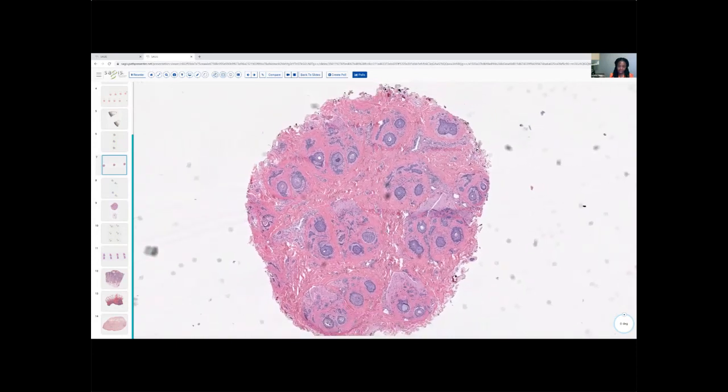We're in the isthmus, but we don't have sebaceous glands, and that's really striking. I mean, these are gone. The sebaceous glands are absolutely atrophic. They are lost here. So let's keep note of that. That's a very important differential diagnostic finding. What else do we see?